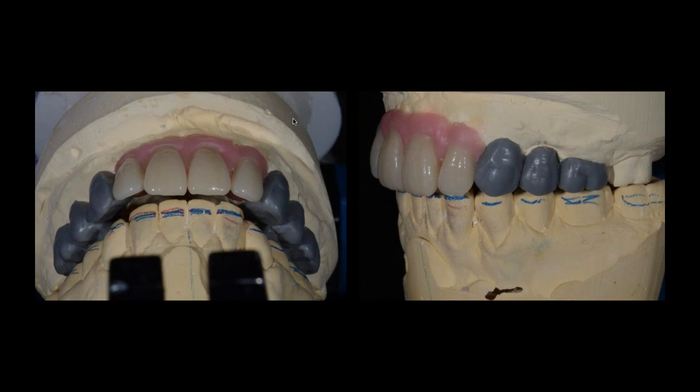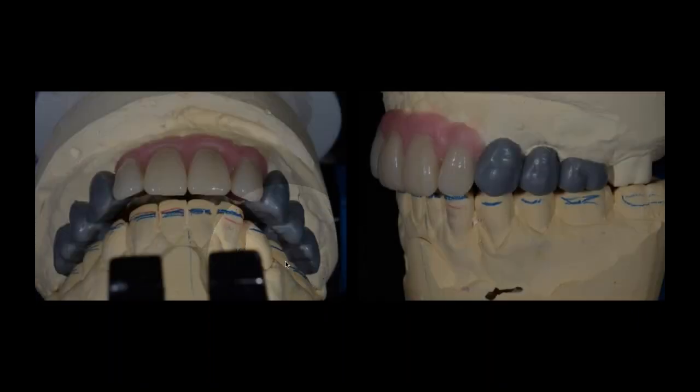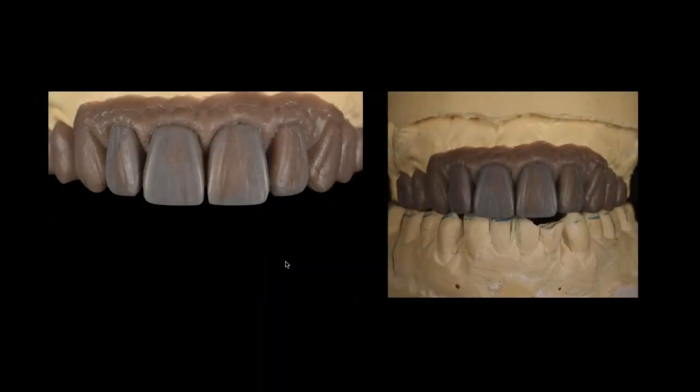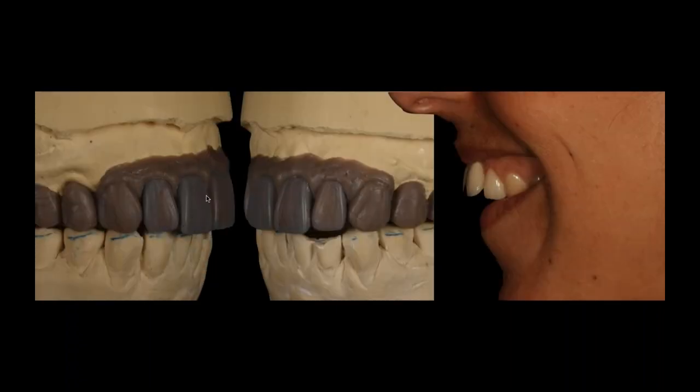So we're going to make a design of where we think the teeth should be. And I did that with a denture setup and an additive wax up. You can see she only has occlusion on 4 teeth. So bicuspid molar, bicuspid molar. That's the only area that she's really going to be touching on. So the occlusal management is really important for us. And in the end, we're going to take that diagnostic wax up and transfer it to a provisional. And that provisional will become our prototype of where we'd like to see her new teeth. And you'll also notice that in my prototype, I'm adding pink because she needs some more pink to support that lip.